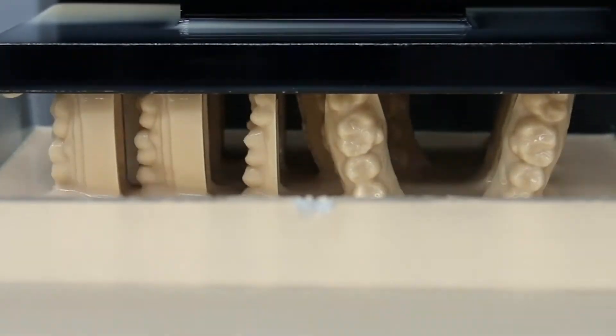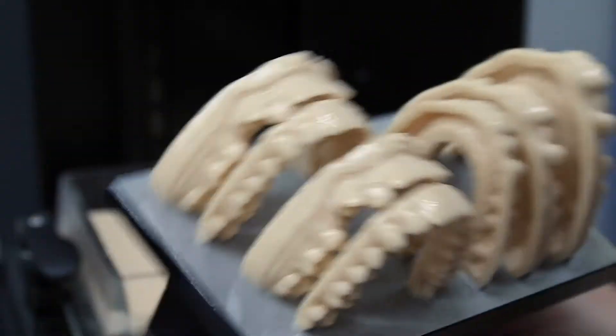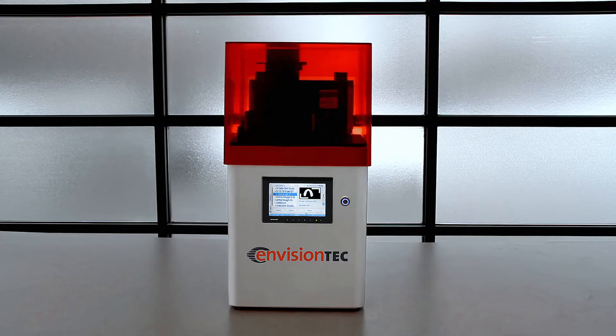There's no bigger game changer in orthodontic care today than 3D printed technology, and no better printer than the EnvisionTech.